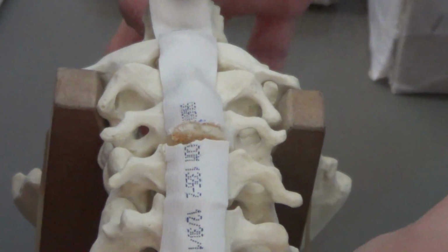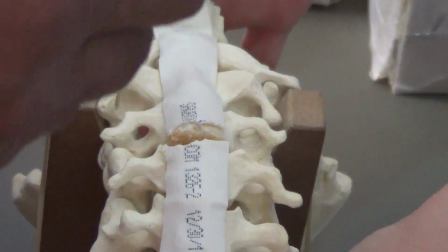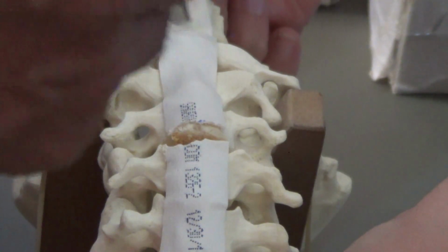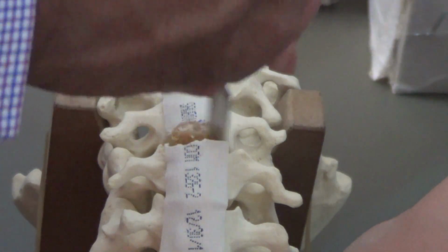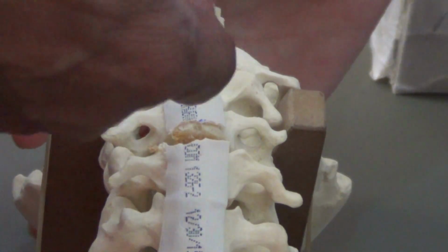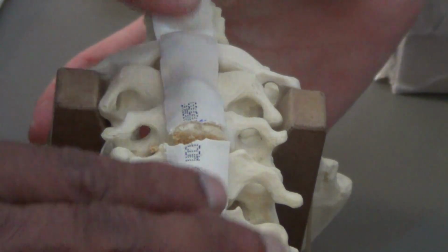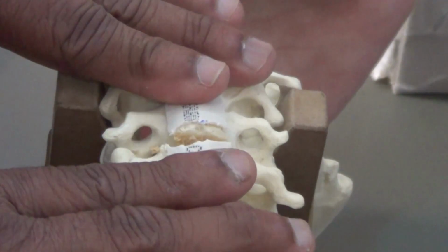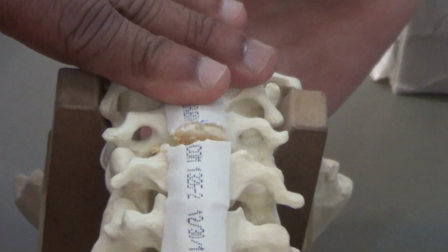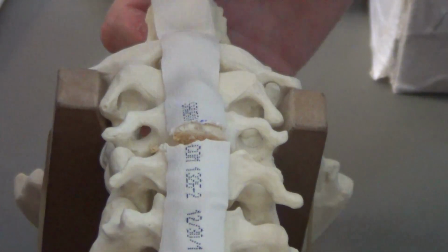Otherwise you will find there will be collapse of your bone graft, or if you are using a cage, there will be a collapse of the cage. After you have burred and straightened, then you tackle the posterior longitudinal ligament and see where the disc has prolapsed. Take out the small prolapsed disc. Once you know there is complete decompression, the next thing to do is to stabilize the spine. How do you stabilize the spine? You can either take a tricortical bone graft from the iliac crest, or nowadays they have come with cages.